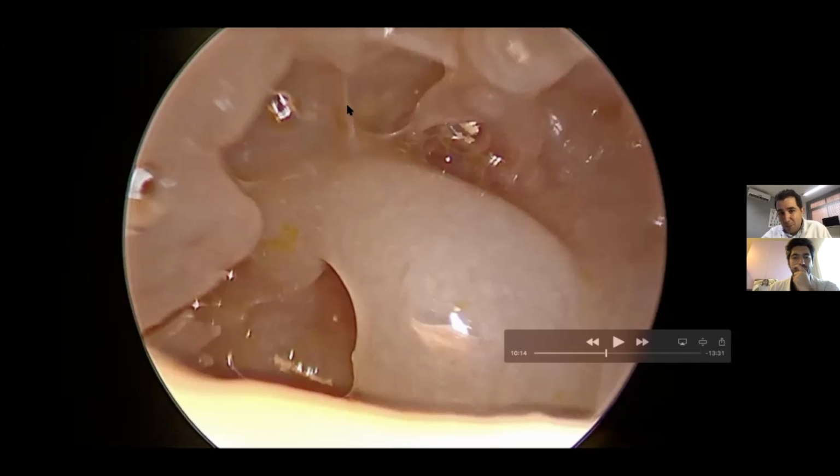Sometimes you can have this small bone, can be bigger, can be smaller, between the subpyramidal space and the promontory. This bone can be bridge-sized, can be wall-sized, or can be absent sometimes. When we have this bone here, we call it the ponticulus, which is bridge. So the ponticulus is very important because it's the superior limit of this region, which is called the sinus tympani. And sinus tympani, if you look in the literature, is the region more prone to residual disease when we talk about cholesteatoma.